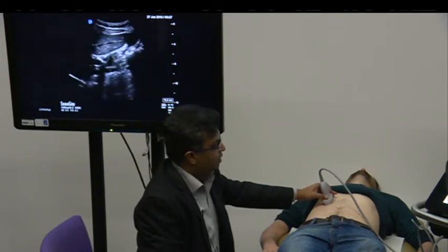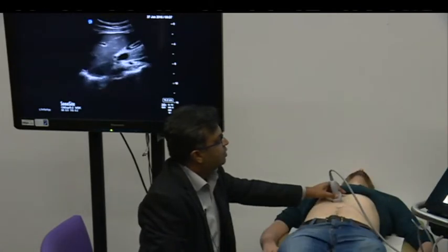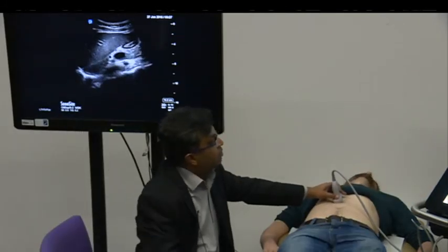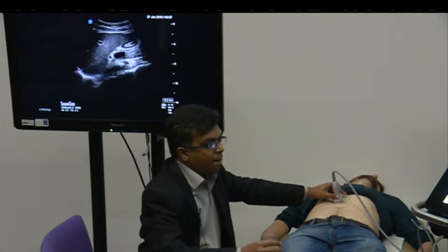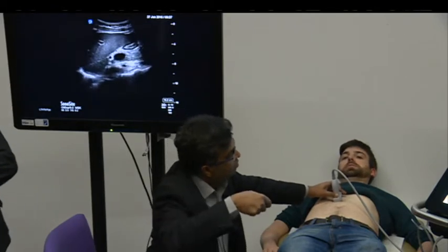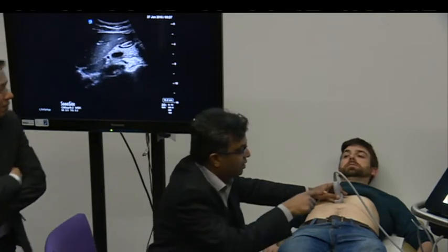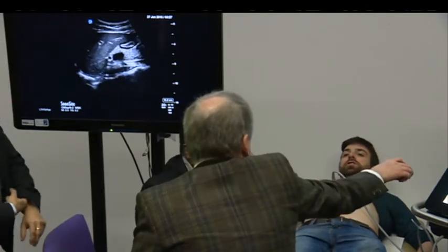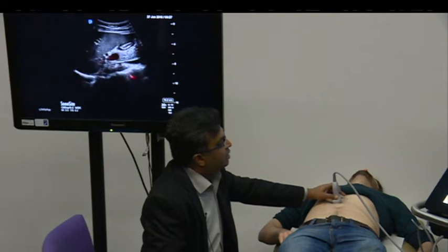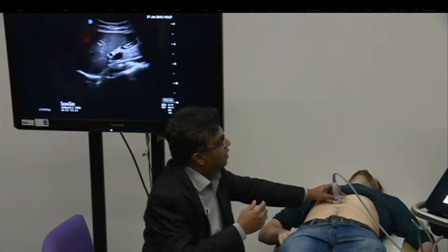Nothing is happening. Has anybody got a pointer? Can you do it on the screen? Yeah - just under the liver, can you see at the top end near towards the abdominal wall there is a kind of a doughnut-shaped structure just under the liver?